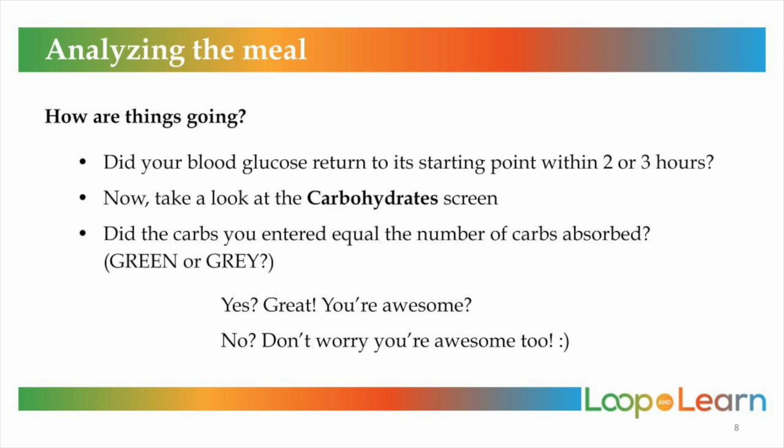After eating, open up the carb screen and take a look as the meal is absorbing, especially at 1, 2, and 3 hours. About 3 hours later, did your blood glucose return to the starting point? Did the carbs you enter equal the carbs absorbed? Yes? Great! Woohoo! You're awesome! No? Well, you're still awesome, and we'll look into this further.